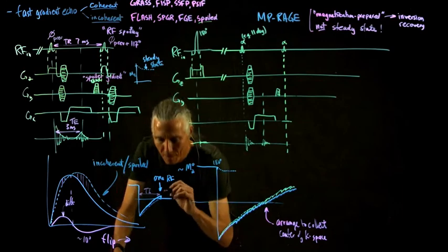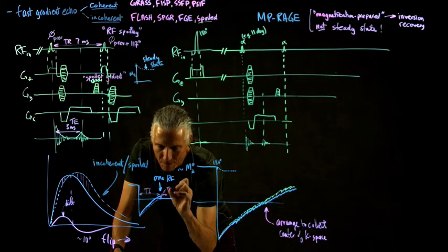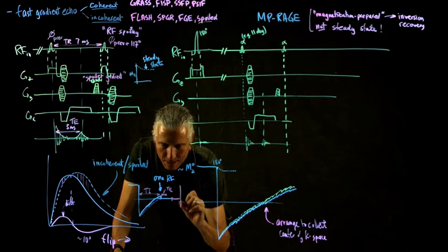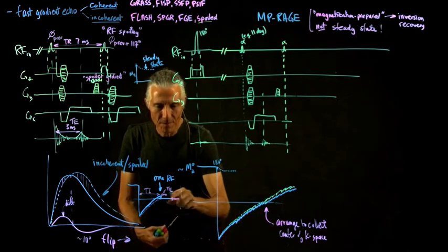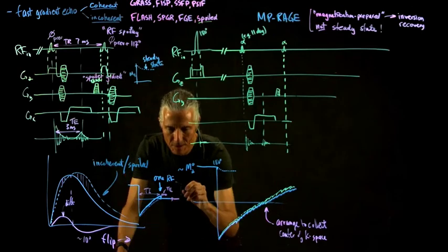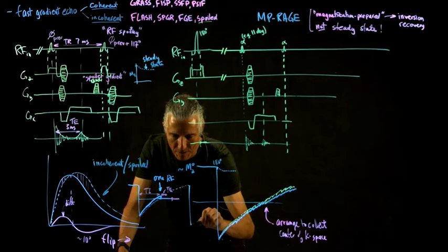And then there'd be a small echo time. The echo time is, here's TE. It's going to be much smaller. And then maybe we wait a little while, and then finally we do another one. So we wait until we recover, and then eventually, say at this point, we do another one.